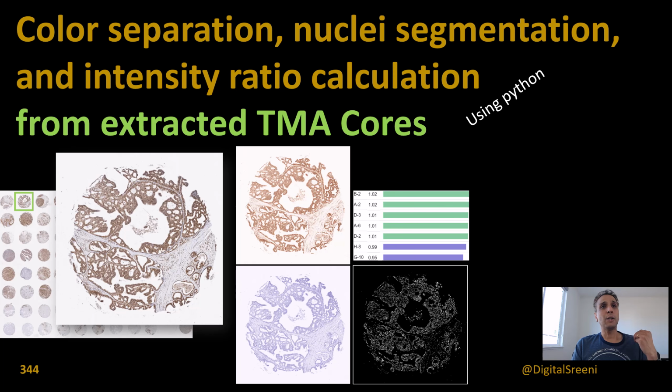So now I have actually done this color separation in the past. I'm going to use exactly the same code. So if you religiously watched all my previous videos, I apologize for a lot of overlap in the content, but of course, there is something for you to learn in every video anyway.